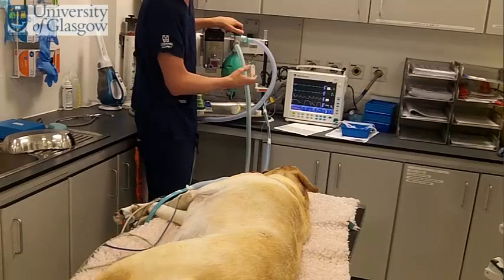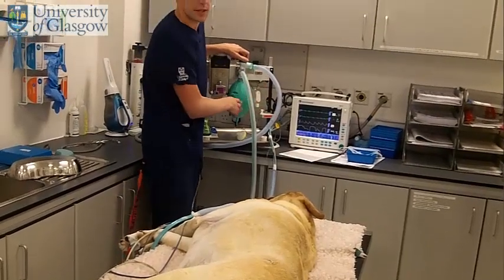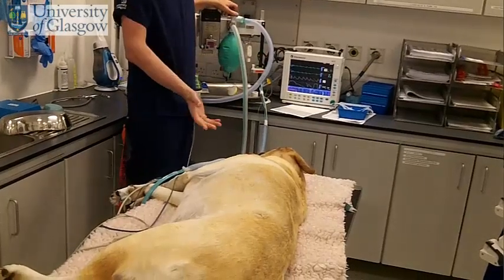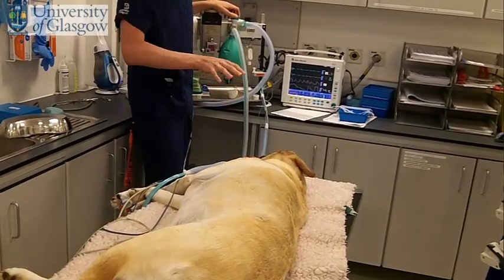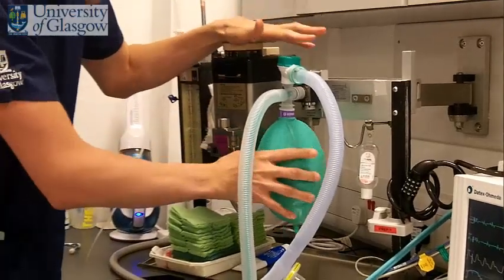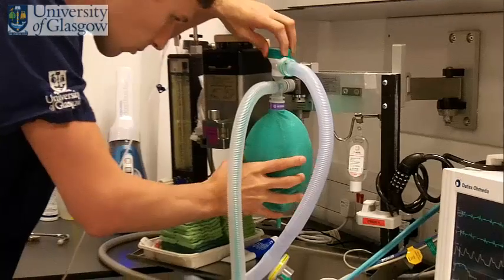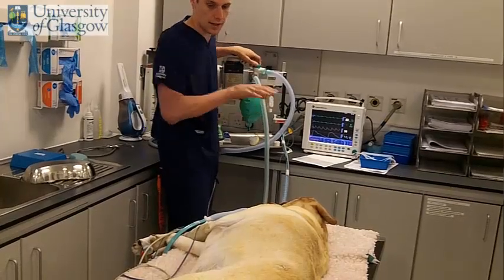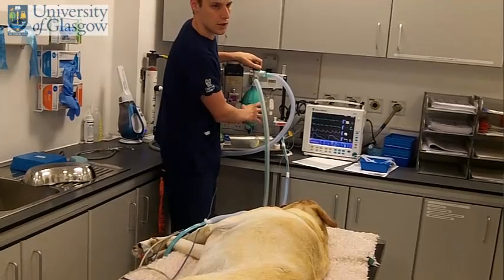To do that, the first and most important thing is to watch the dog's chest quite carefully. It's very easy when you're breathing for patients to over-inflate them, and the best way to figure out if you're doing that is to watch their chest, not to look at the bag. A lot of people spend all their time watching the bag and don't actually look at the dog. You need to work this with your hands and look at the patient while you're doing your IPPV.